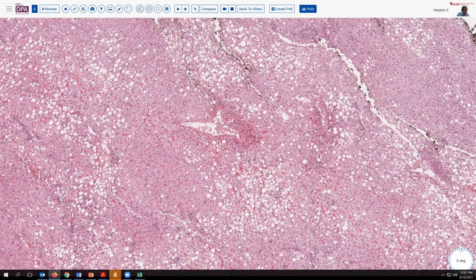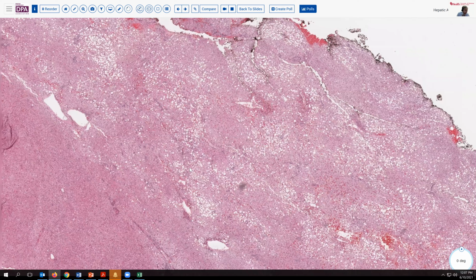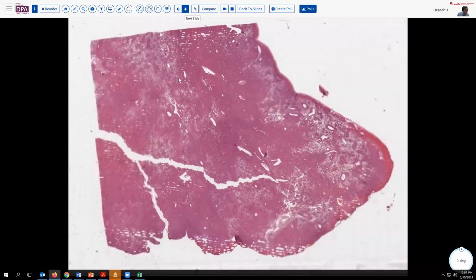So as I've indicated, the margins on these adenomas can sometimes be very difficult. Seeing fatty change in an adenoma is also possible and shouldn't dissuade you from thinking that it's possibly an adenoma as well. Here's another example you can come back and study. Again, the margin can be very difficult to discern at some points, but this was another example of the adenoma.